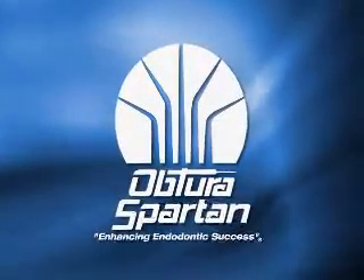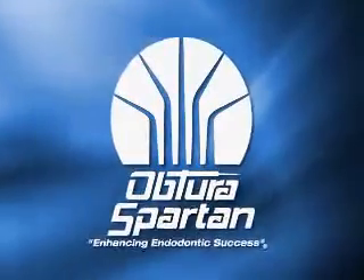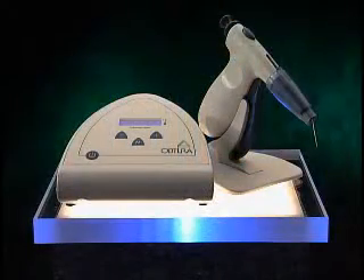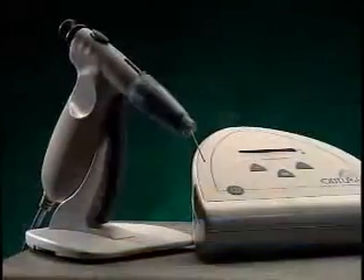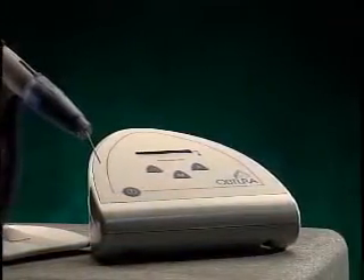Congratulations on your purchase of the Obtura heated gutta percha obturation system. First developed by a group of dentists in the late 1970s and available to dental practices since the early 1980s, this newest generation of Obtura promises to improve your productivity and deliver superior quality health care.